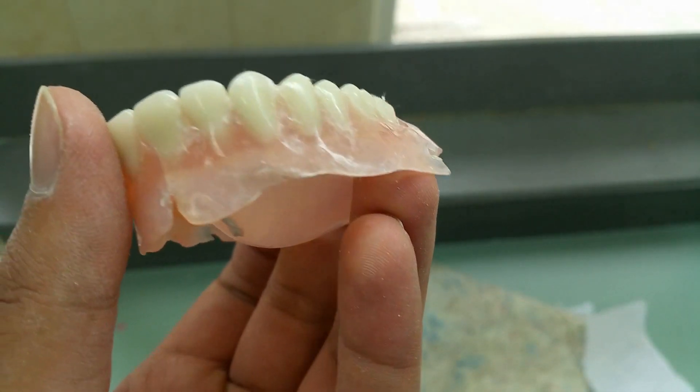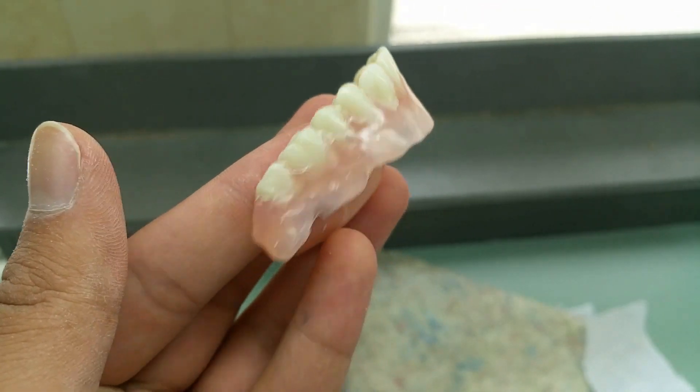I also learned that during polishing, do not press too hard onto the polishing instrument. It was a very hot day when I did mine, and pressing really hard caused extra friction and heat between the denture and the polishing burr, which damaged my denture. Take your time, don't press too hard, and you will get very good results.